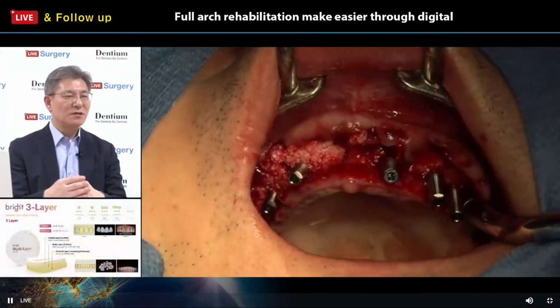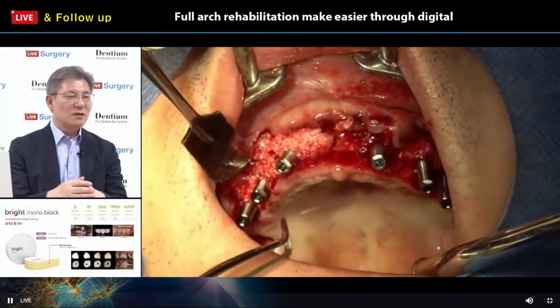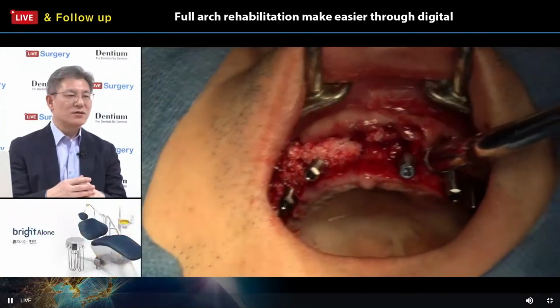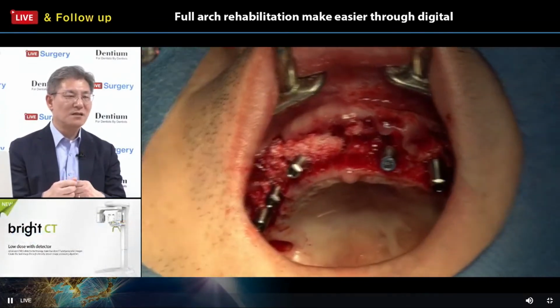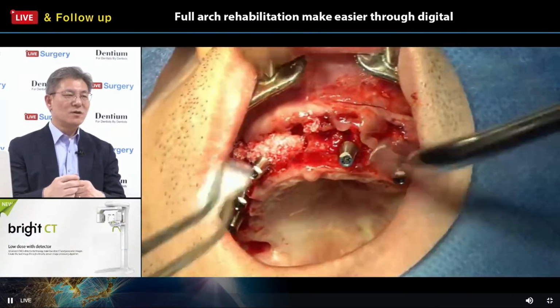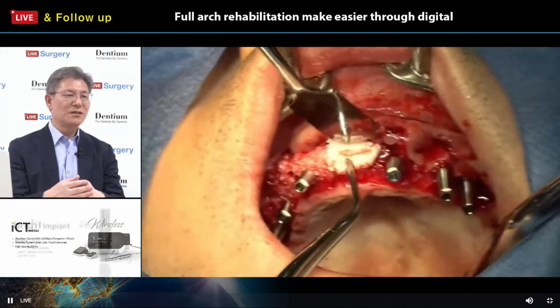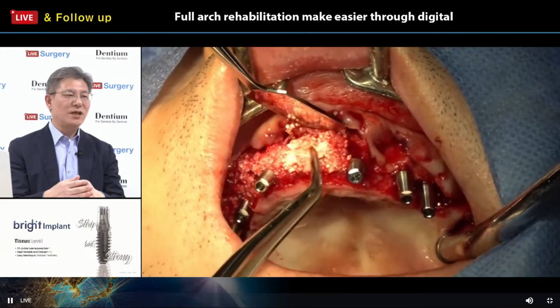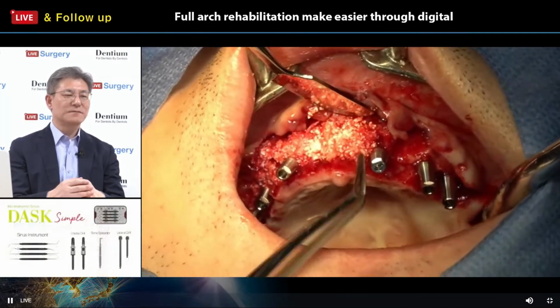As I mentioned before, collagenated bone was used. First, Osteogen collagen. Osteogen collagen means Osteogen particulated bone intermingled with a collagen binder. Osteogen came from bovine bone, bovine origin. And this one is Osteon 3 collagen, the alloplastic graft material.